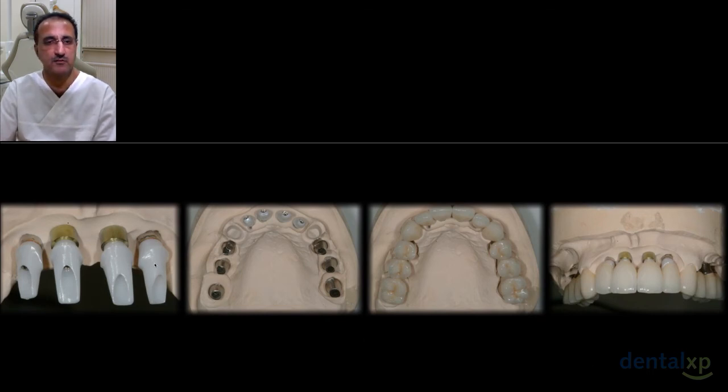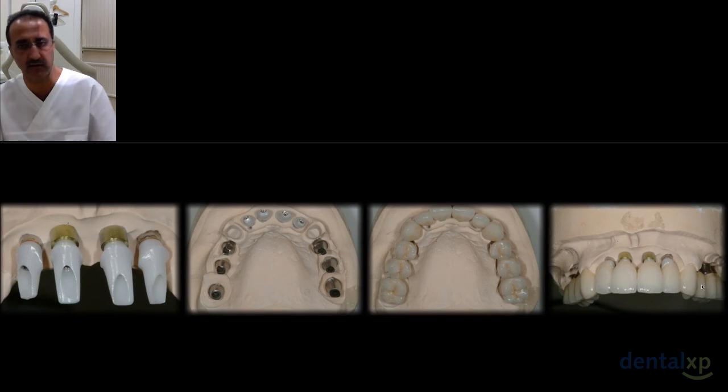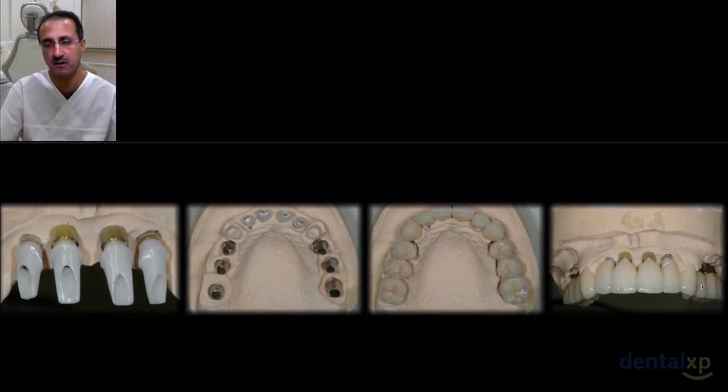And you can see us going through the various steps. Here's the design of the abutments, its concave shape, and we decided to go for zirconia abutments in the anterior, titanium abutments on the posterior, PFM restorations posteriorly, and single unit alumina restorations on the anterior. Probably today we would use Emax, but this is a little while ago.